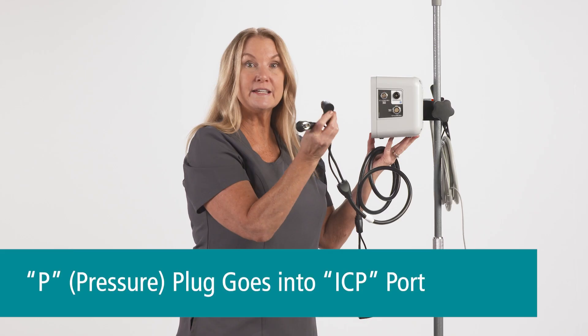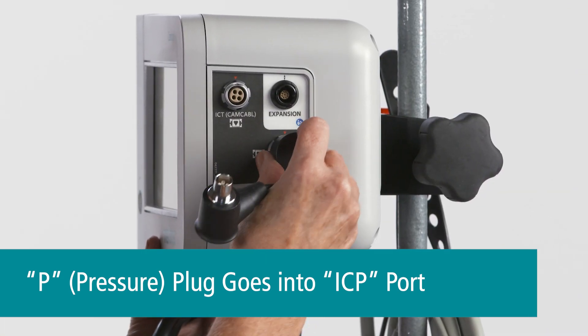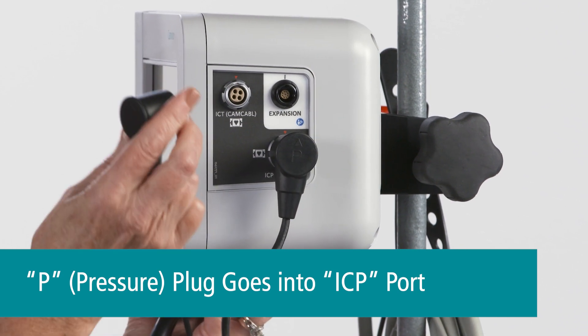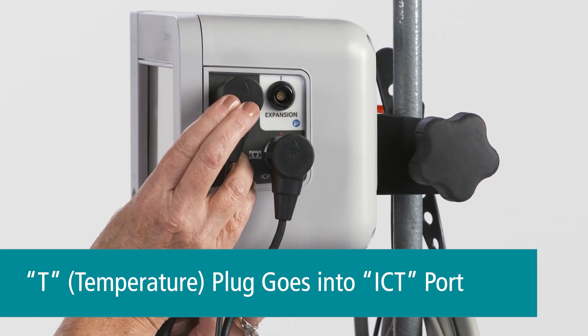The connector that says P connects to the ICP port — align the dot to the arrow and push. The connector that says T connects to the ICT port — align that and push.